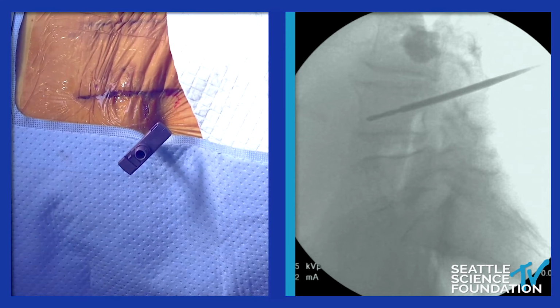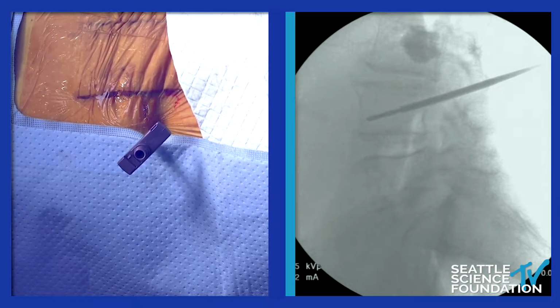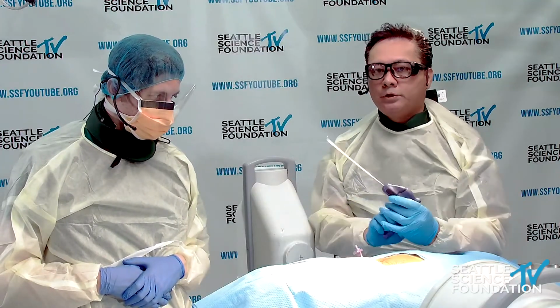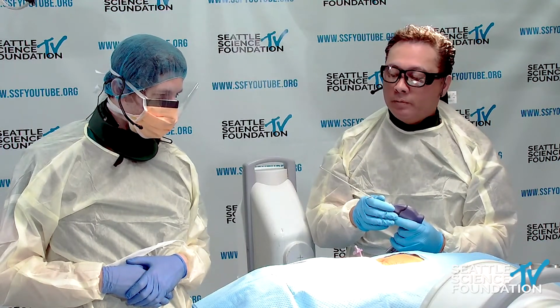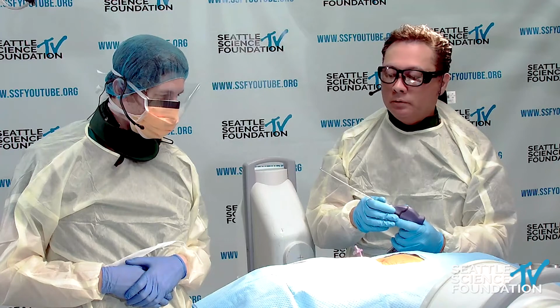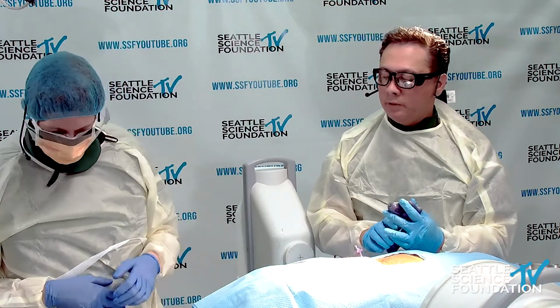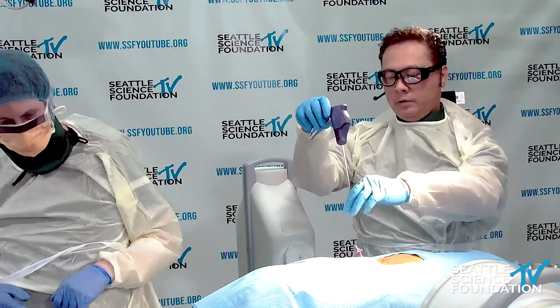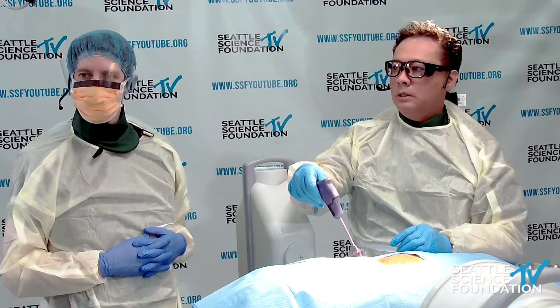Now, with this company, Medtronic, there's a curette, and as you can see here, it helps to provide some coring out of the actual vertebral body even further before we inflate the balloon. We're going to use a 15 millimeter balloon on this side in particular. Now look at the actual radiological view.